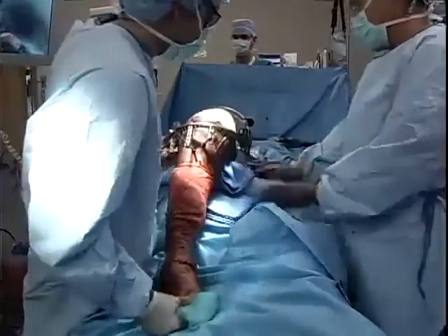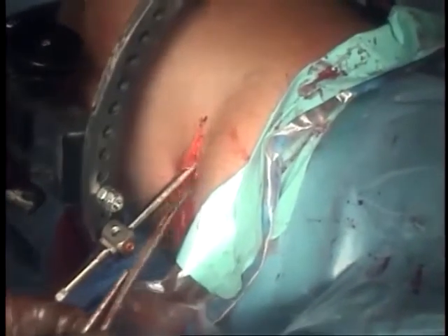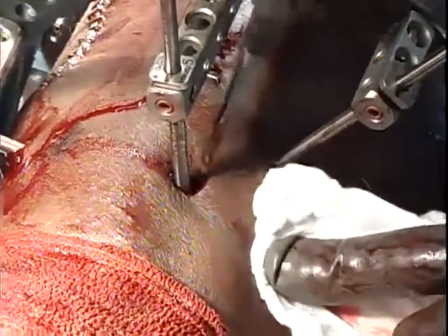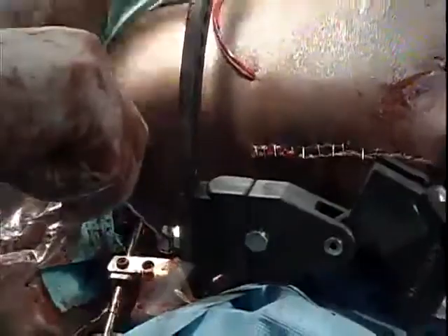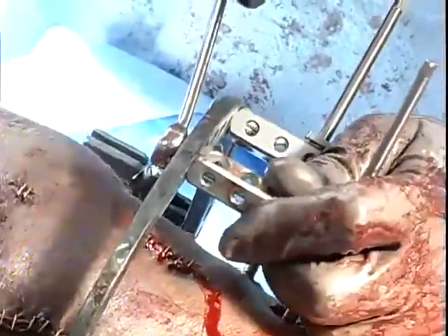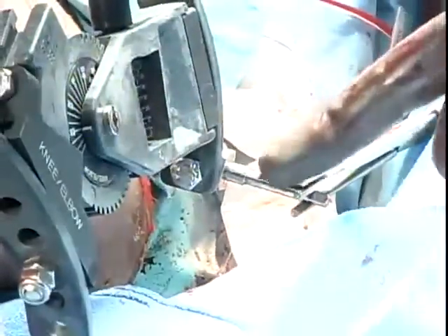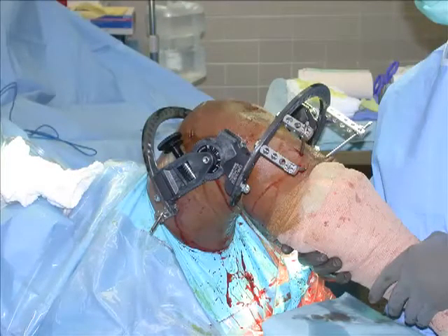Check that no skin is binding on the pins, especially the femoral pins. The posterior skin often binds, which will cause pain with flexion — use a knife to release it. If desired, close some skin anteriorly but leave a nice loose pin site. Do the same for any tight tibial pin sites. Once completed, tighten all bolts and nuts — double-stacked nuts should have only the outer ones tightened to avoid rotating the hinge. Cut off each pin: femoral pins are cut where they get thicker. The hinge is now placed, allowing sagittal-plane flexion while controlling varus-valgus stress and rotation to protect fracture fixation or ligament reconstruction.